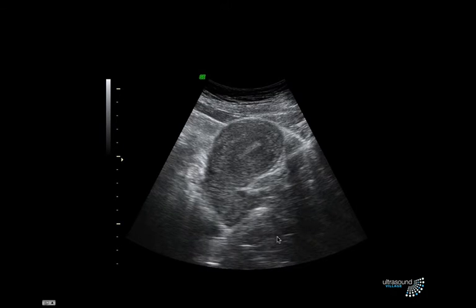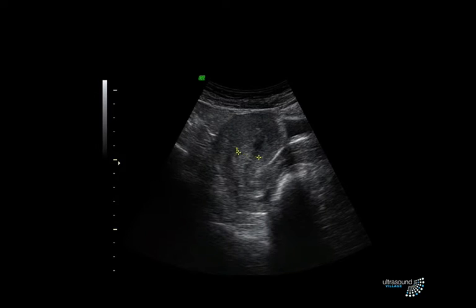And another case, same again. See, now we're getting a pattern with an empty bladder and an anteverted uterus. This is what it looks like. Here's another one. Vaginal stripe, this double vaginal stripe. There is the lumen of the vagina coming down. Here's the cervix. Here's the fundus of the uterus, bent forward, really anteverted, empty bladder, bowel material, bowel gas. And the anterior abdominal wall here is actually abutting the uterus, so that you push the gas out of the way by pushing in. This is air in the rectum here.